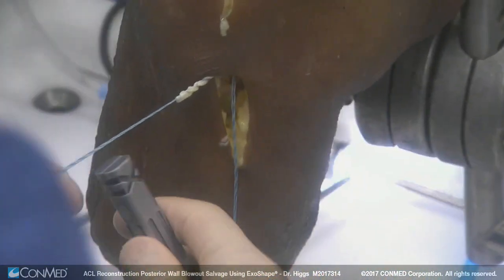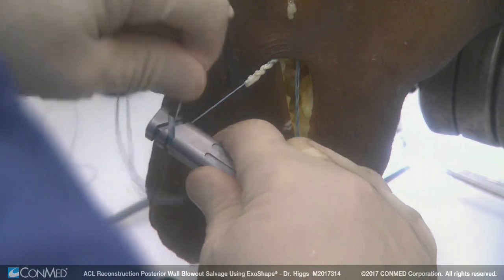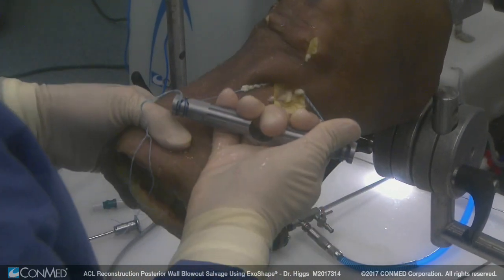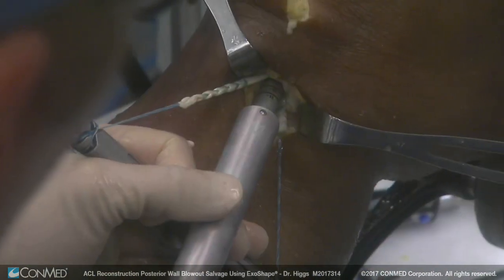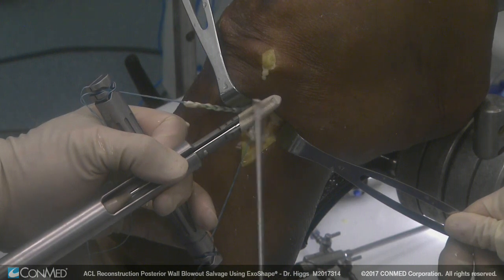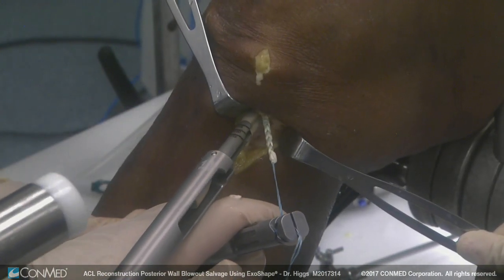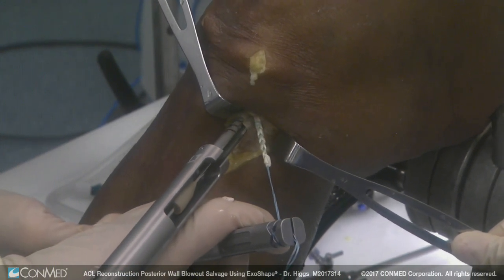On the tibial side, we take our graft, slide it in on the tensioner from the edge, and wrap this around several times at different angles because I don't want this slipping at any point. I move the knee through a full range of motion through several cycles — this gets rid of the creep. Now I'm going to go back to my dilators, compressing the cancellous bone against the tunnel walls. I want to put this slightly deep to the cortex. This is the more distal portion, created at an angle. If I rotate this about 30 degrees and then insert between my bundles, I'm going to get the right orientation.